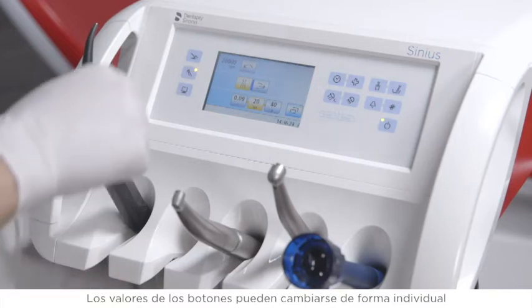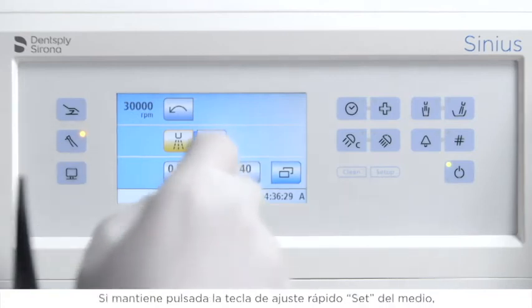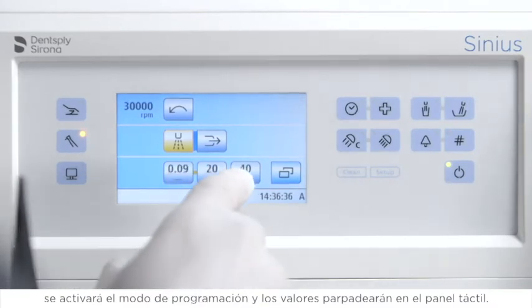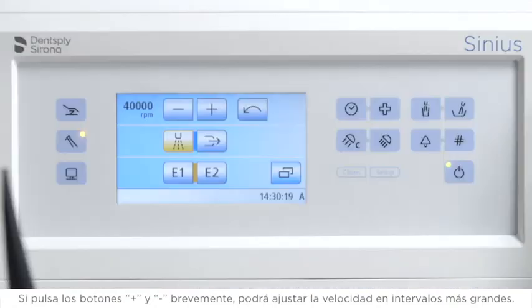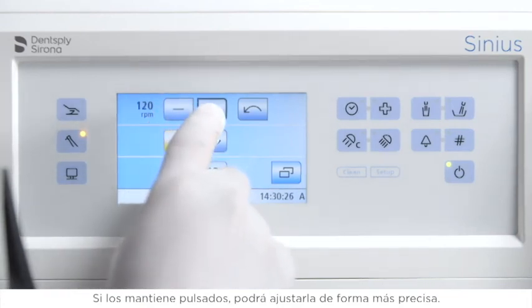The button values can be changed individually with the programmable quick setting keys. Pressing and holding the middle Set Quick Setting key activates the programming mode and the values flash on the touch panel. Briefly pressing the plus and minus buttons, adjust the speed in larger increments. Pressing and holding the plus and minus buttons enables fine adjustments.